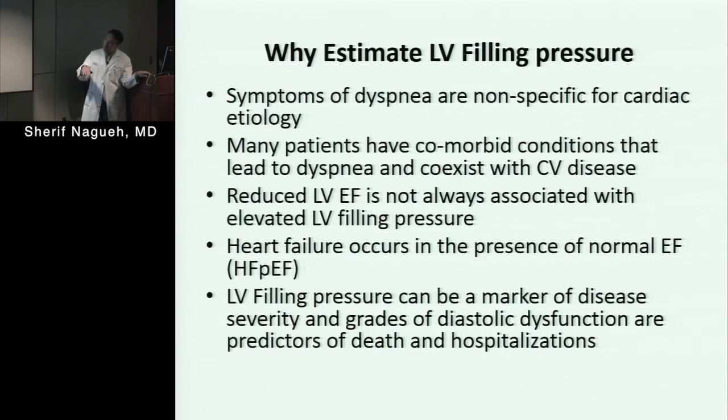The flip side of that is sometimes we see patients who have a normal ejection fraction who are in heart failure, a condition well recognized as HFpEF. So equating imaging or echocardiography with ejection fraction to diagnose the etiology of dyspnea is not a good tactic or strategy to take.